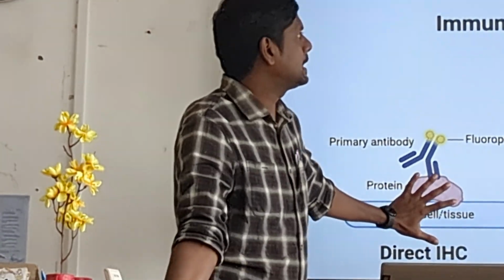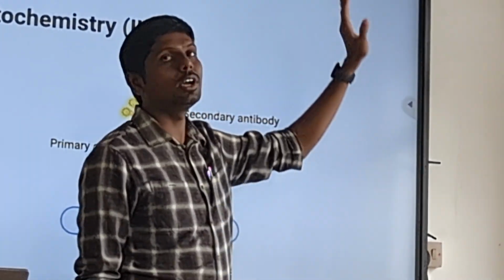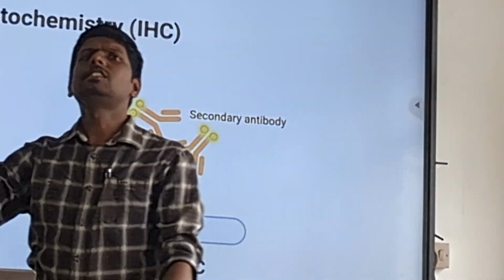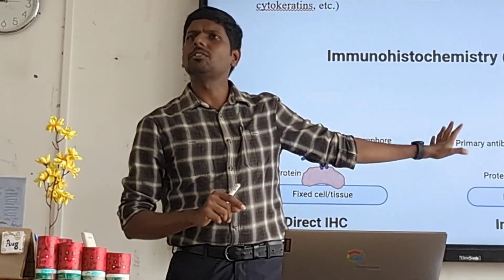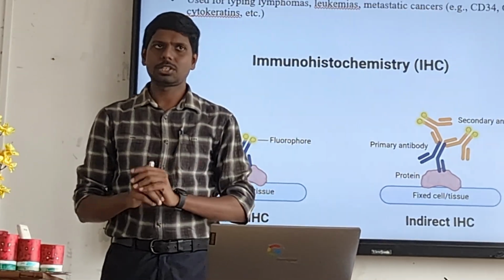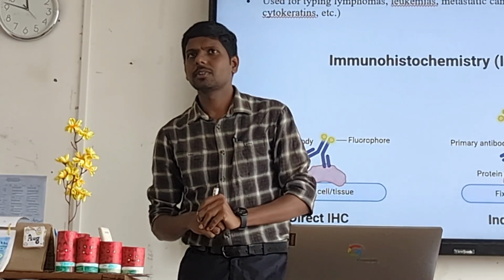The protein markers, including CD34, CD20 for various cancers, will be detected with the help of IHC. Or simply, if we don't have flow cytometry, we can do a manual flow cytometric test. That will be the immunohistochemistry. This is the test before flow cytometry was invented. Okay, simple.